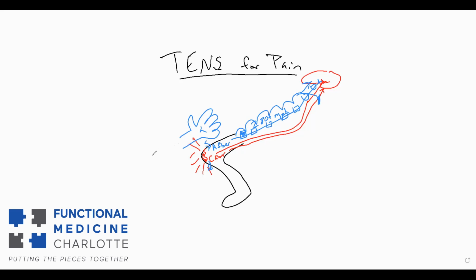Yeah, it's kind of like you're using the TENS unit instead of an NSAID medication. So it's a pain reliever. So it's just how long do you want the relief while it's on. And if you're going to use it for muscle contraction, I wouldn't go over 10-15 minutes at a time.